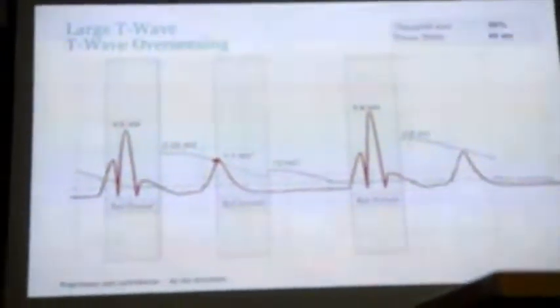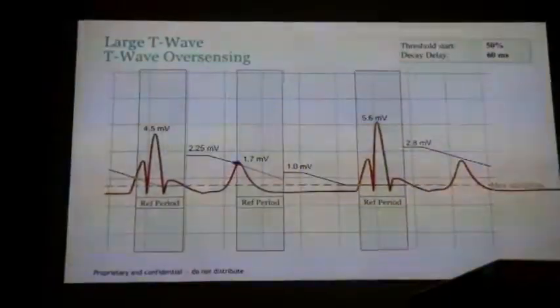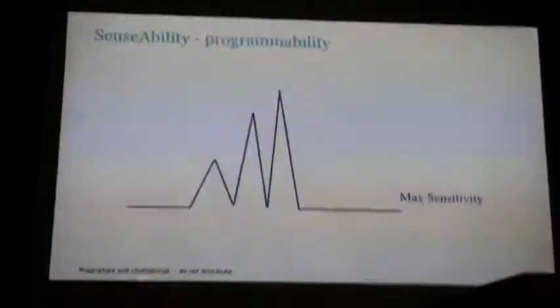Do you redo the VF test with the induction after changing such parameters? That is a consideration, but we leave that to physician decision. We say you have changed the sensitivity of the device. If you make these numbers bigger, you make the device less sensitive. So we would say you should consider doing a defibrillation threshold, and then you make the call, like you do with important decisions every day of your life, every minute in your job. We can't make that call. We just say these are programming options that you may have. So, a little bit of a quick review.